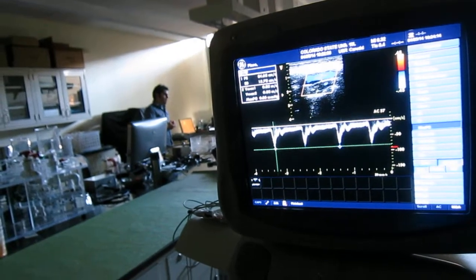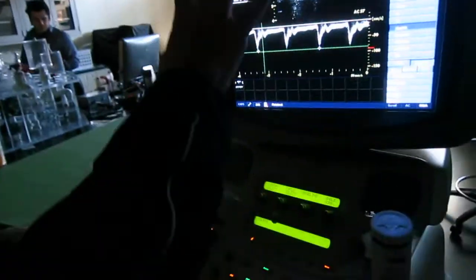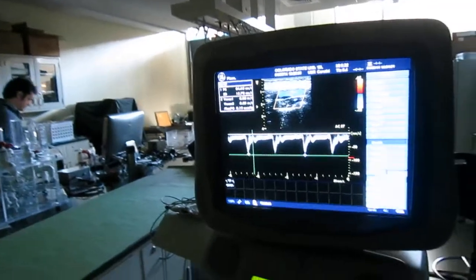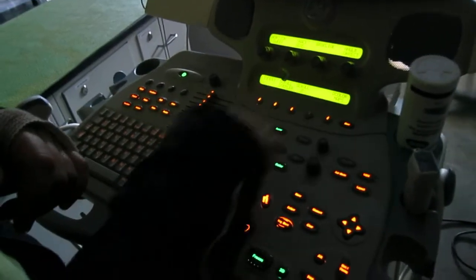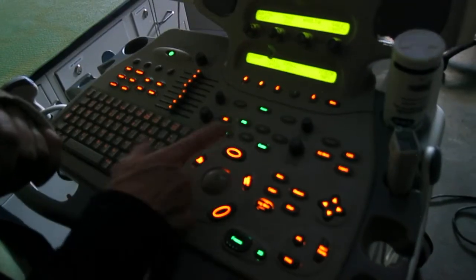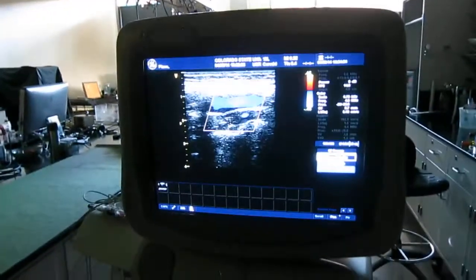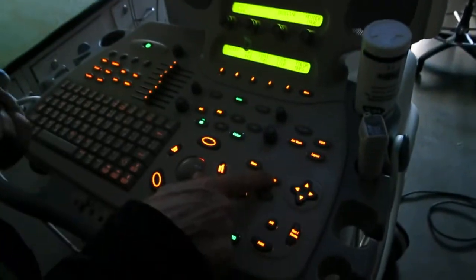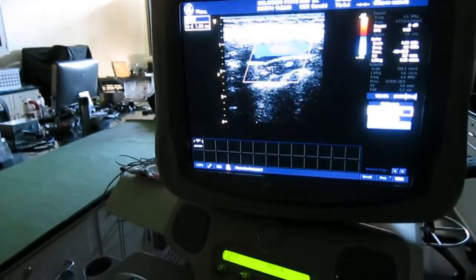And then how again do you measure like a width on the... Okay, so this is your velocity. Yep. Okay, and let's get out of here. We'll get out of the spectral Doppler because we don't want this trace. You could actually keep this and still measure this if you just get out of the pulsed wave. It'll just do the 2D. Okay. Then I'm going to push caliper. Okay, and I'm just going to set the first point.